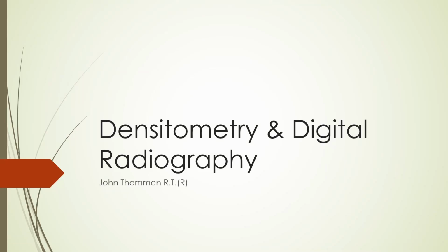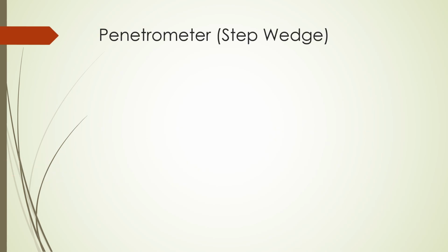While densitometry is an archaic form of image analysis, I have found that some of the concepts embodied in densitometry to be helpful in understanding digital image formation, especially when one considers radiation exposure. To perform a densitometric analysis, we start with a device called a penetrometer.